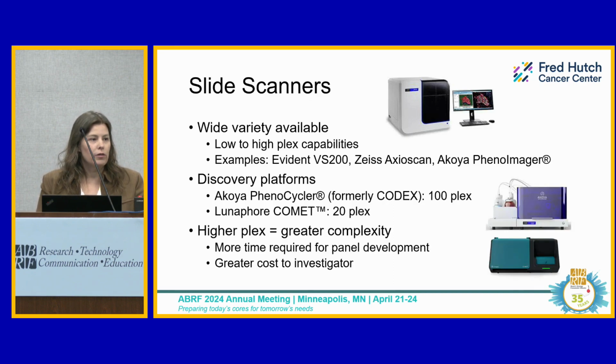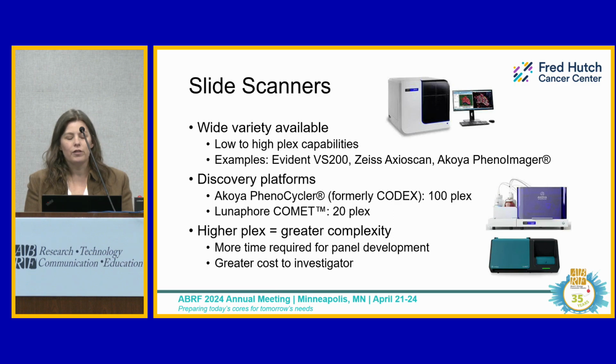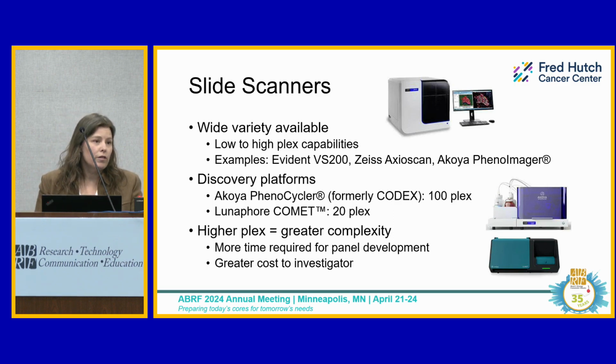One thing to note, however, is that the higher the plex of the panel that you're putting together, the greater the complexity of making sure that all the pieces are working together appropriately and that the staining pattern is still making sense based on the biology of the tissues and known expression patterns. So it will take you more time to develop these panels, and time is going to translate into money. These are going to be more costly panels to develop de novo for investigators.